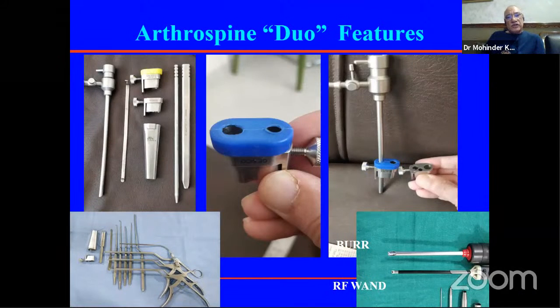In saline mode also, you can see the working insert is changed. There are only 2 ports now. Through one side, fluid goes in and it comes out through the other side. And you can see this is a specially designed scope by me.